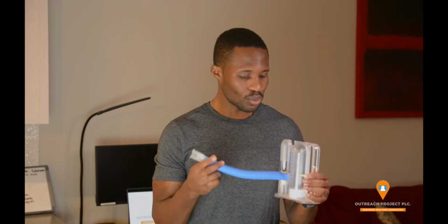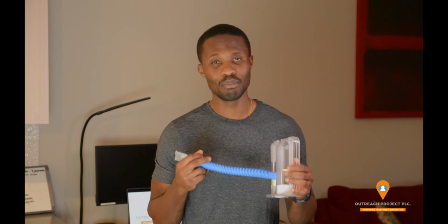So this is the primary use of the incentive spirometer: to improve inhalation. Like I mentioned from the start, you would typically notice that a patient might need help with inspiration just by observing them. You will see they're taking shallow breaths and not taking full deep breaths when you see them at rest. Using this device really helps them.